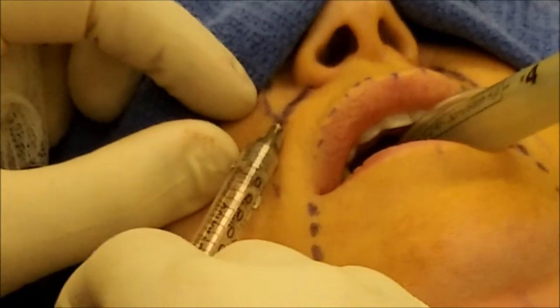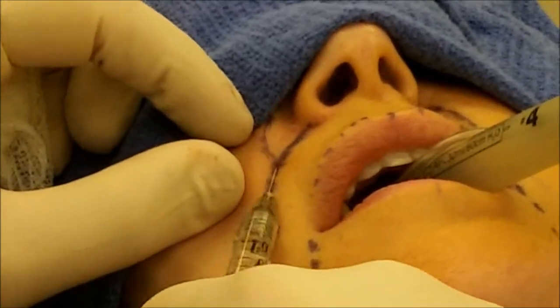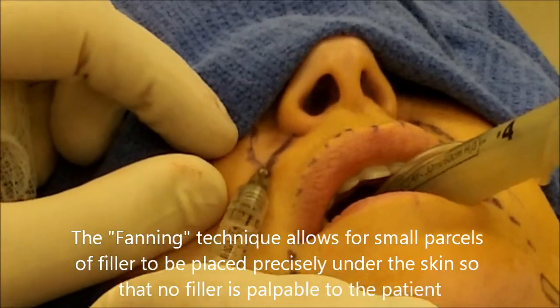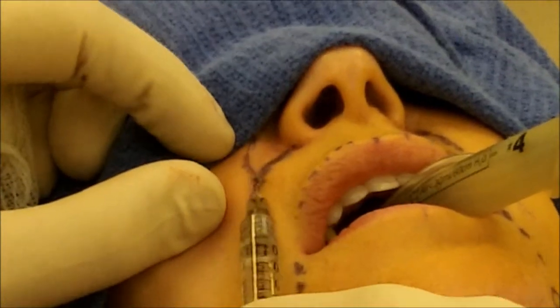I go to a different location and again, small amounts as I'm filling and pulling out the needle. I just keep changing — it's called the fanning technique. The syringe goes right under the skin, and it's very hard to see. I'm just putting little amounts in at a time to really fill that as we go.